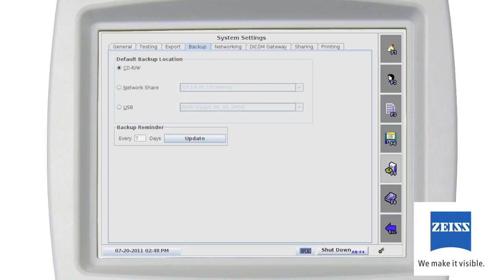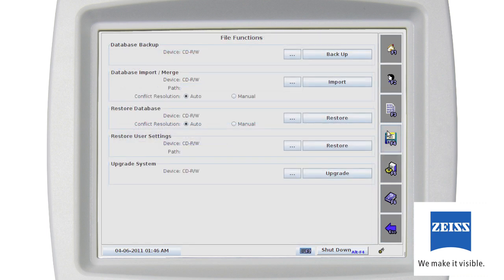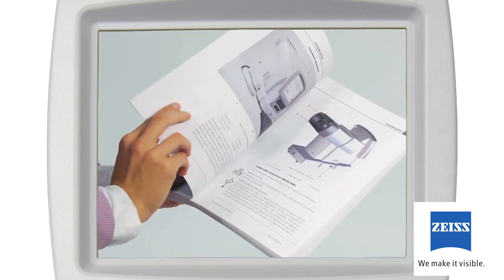You can backup the Humphrey Matrix database to a CD, USB drive or disk, or network location. You should backup your database regularly on a schedule that fits your practice. To make a backup, in the File Function screen, select Database Backup and choose the location in the dialog box that appears. The user can merge Humphrey Matrix databases from multiple instruments into one if desired — a conflict resolution feature helps minimize and eliminate duplicate patient records. Restore Database restores the latest full backup and all partial backups. Choose Upgrade System to upgrade system software with new releases provided by Carl Zeiss Meditech.